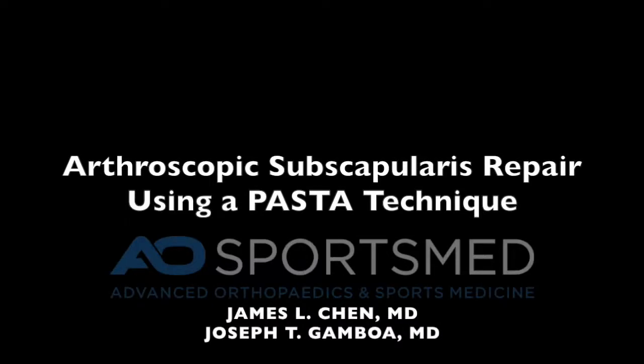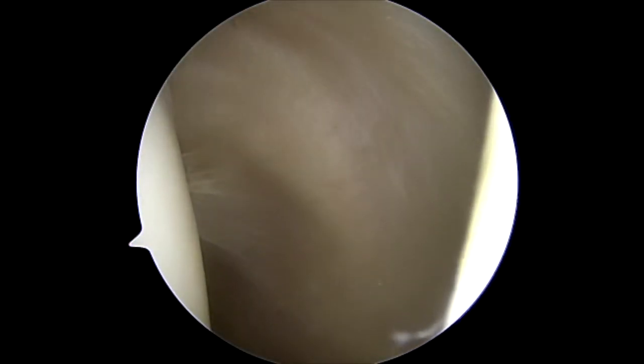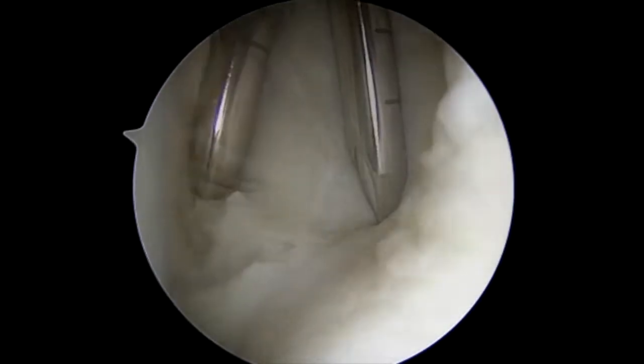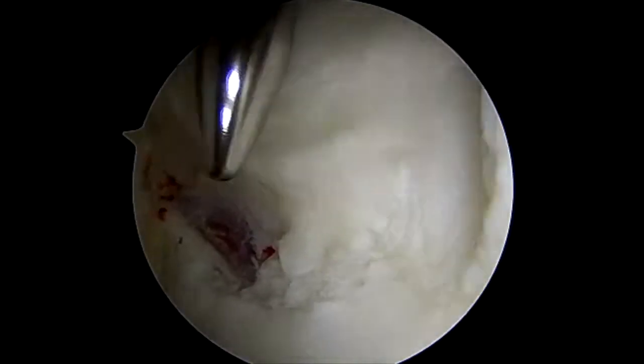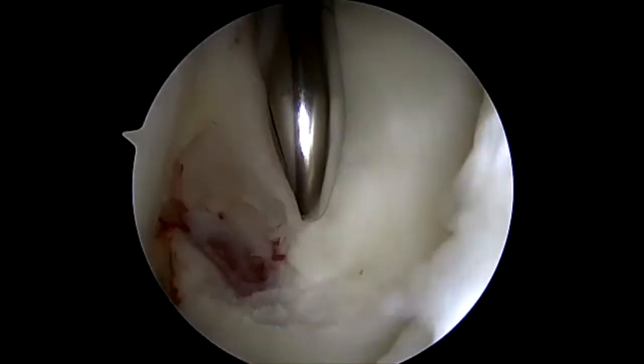This is a technique video on arthroscopic subscapularis repair using a PASTA technique. Here I am looking into the glenohumeral joint and probing from the anterior portal a partial thickness articular-sided tear of the subscapularis that is in the mid portion from inferior to superior.